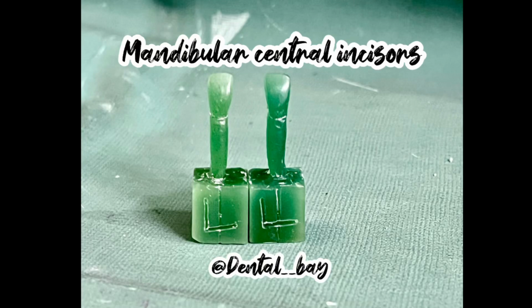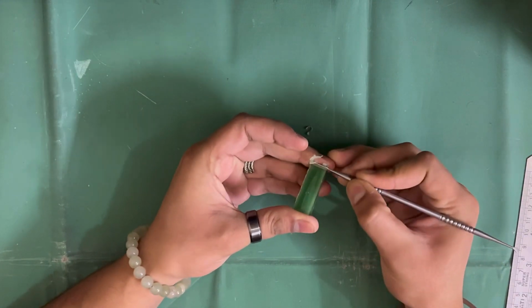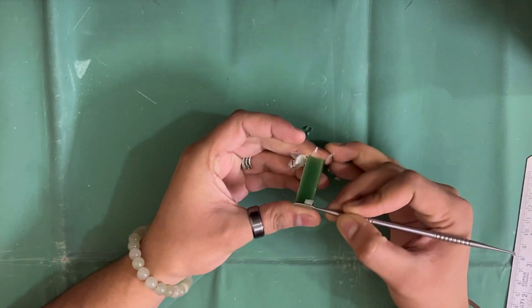Today we're gonna carve the mandibular central incisor. In this video, we're gonna carve the left mandibular central incisor. So let's get started. First we will smoothen out all the surfaces using the blunt end of the carver.